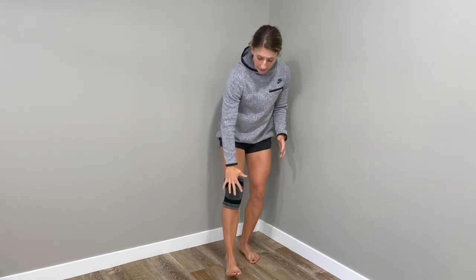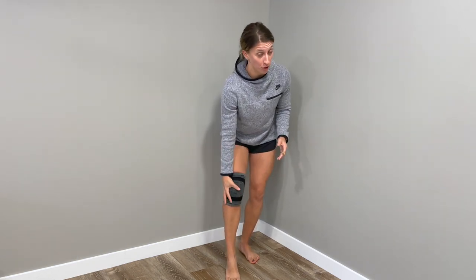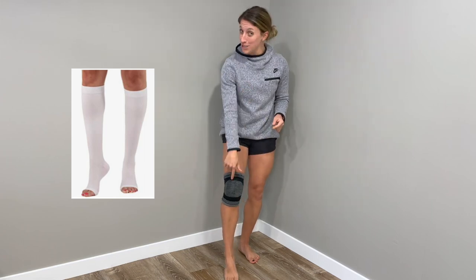You can get knee sleeves in neoprene or in a cotton form, but it is a totally soft brace. There are no hard parts in this brace. It's similar to a compression stocking if you've ever worn one of those, although easier to get on.